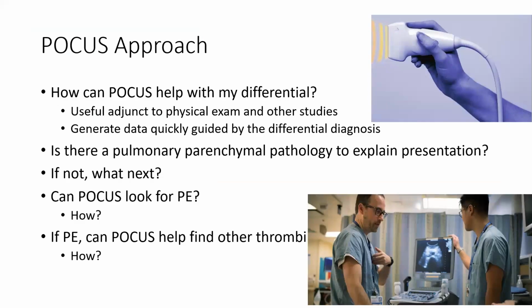So based on the differential that we've come up with based on this patient's presentation, how can we apply point of care ultrasound? I think point of care ultrasound makes me a better doctor because I have to think, what am I looking for with my ultrasound? So it makes me form a differential diagnosis before I just slap the probe on. If you're not thinking about what could be causing the problem, then you're not going to find it. Further, point of care ultrasound doesn't replace anything in our workup. It's a supplement, a very powerful supplement to the workup, but it should just be used to augment and support and work through your differential.